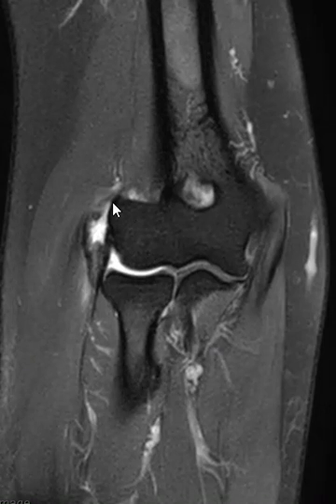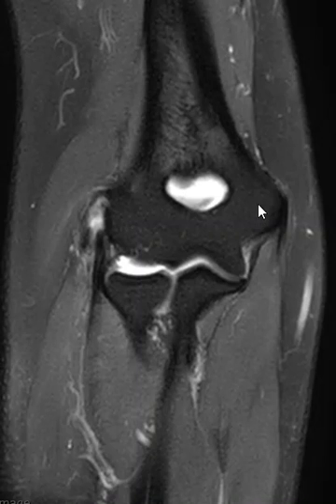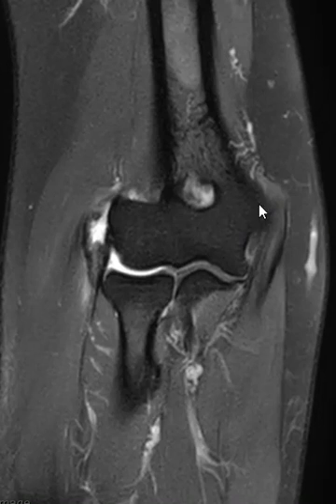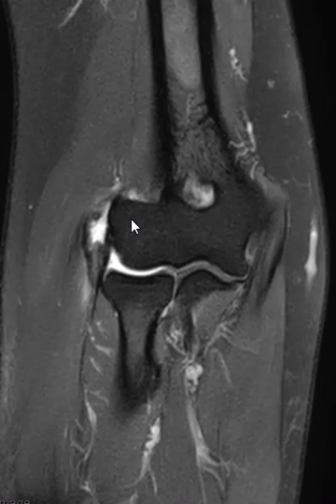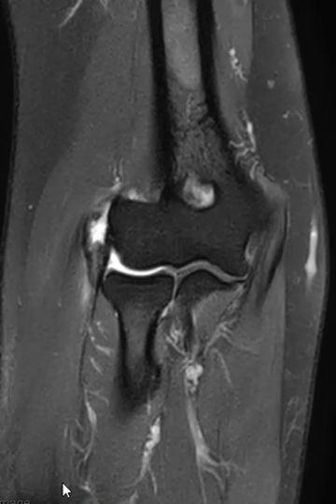We see the lateral epicondyle over here — this is the epicondyle, here's the medial epicondyle, and the radial head here. We see this fluid signal overlying the epicondyle, and the common extensor muscle group is down here in the forearm. The extensor muscles come together to form this common extensor muscle group.